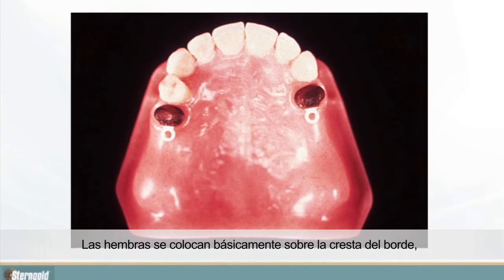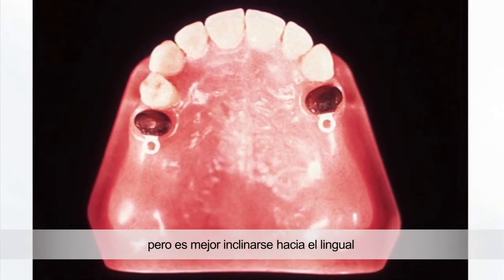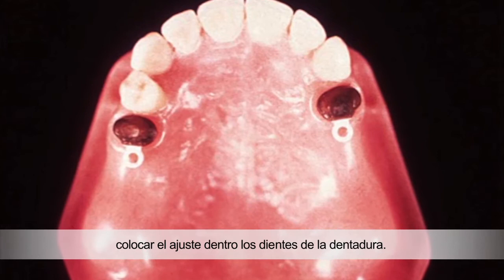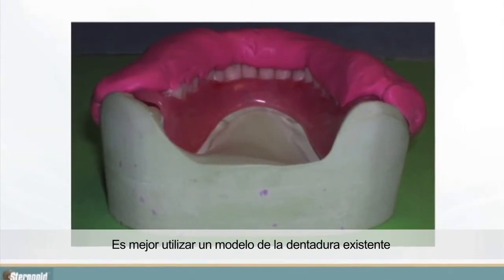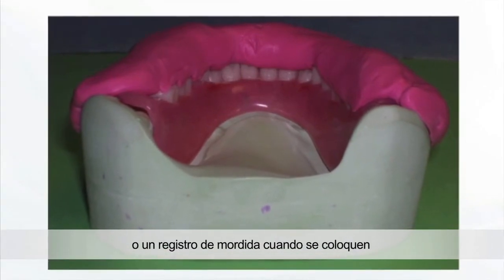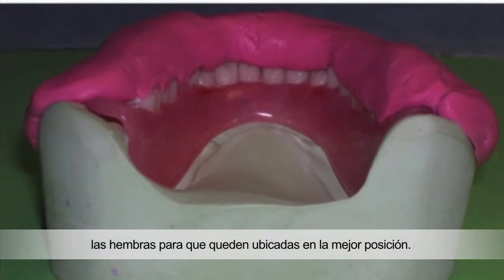The females are placed basically along the crest of the ridge, but it's best to cheat slightly to the lingual, so that it will be easier for the denture technician to properly house the attachment within the denture teeth. It is always best to use a matrix of the existing denture or a denture setup when positioning the females so that you can place the females in the best position.